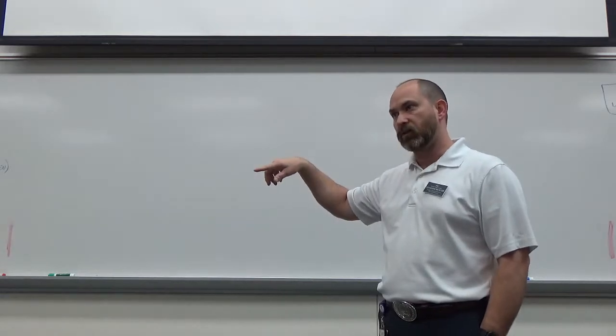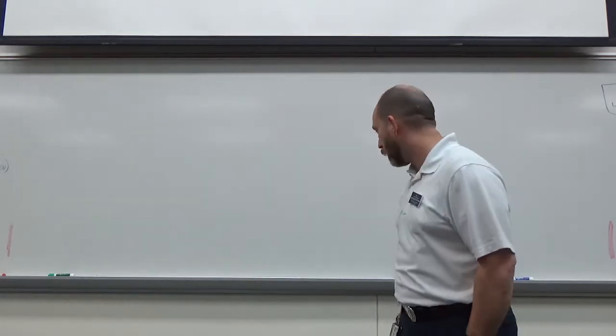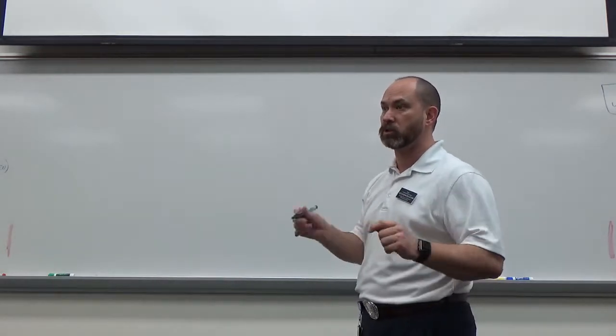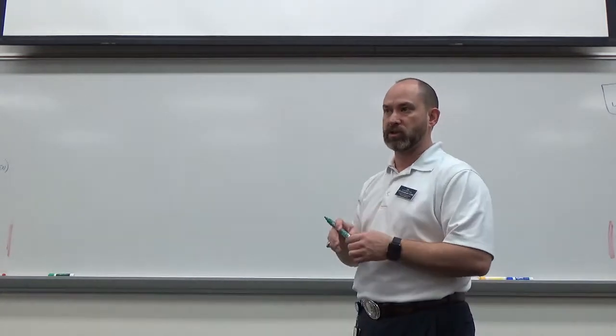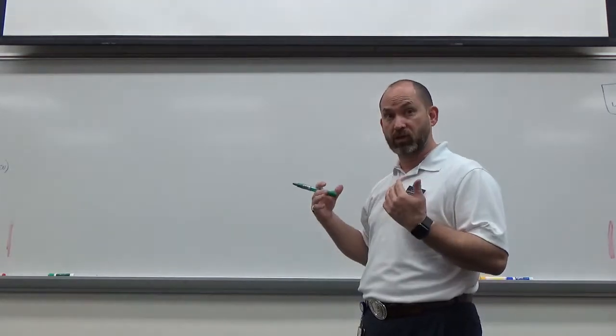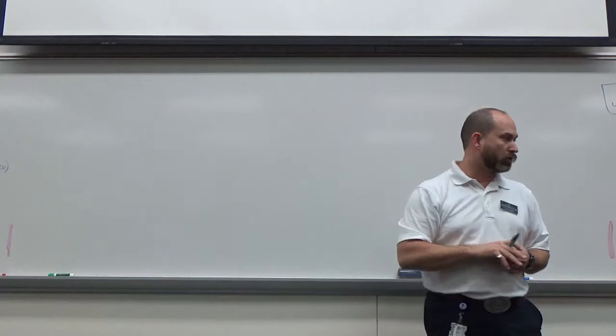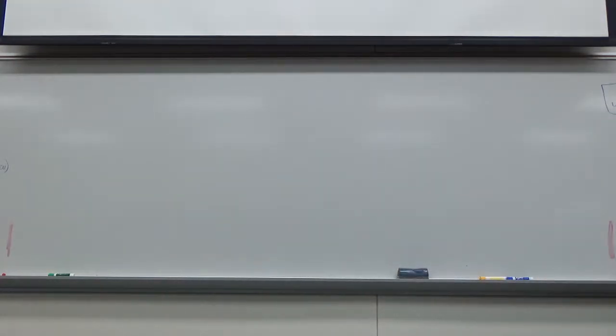We've got the diastasis in between, then we get the A kick. As we get more abnormal, and it could be due to valve pathology, that deceleration time could change. If it's due to stenosis, it's going to look different because of the stenosis, which is different from diastolic function. So know what a normal looks like at this point, so then we can start separating it.